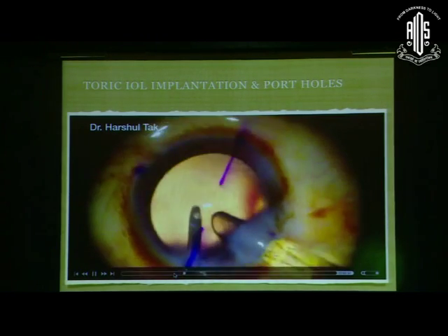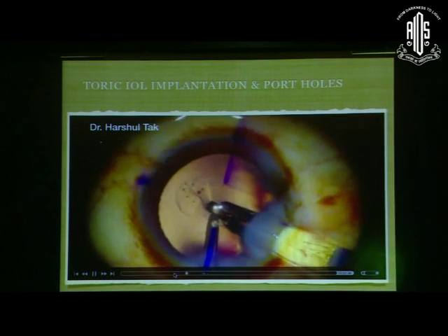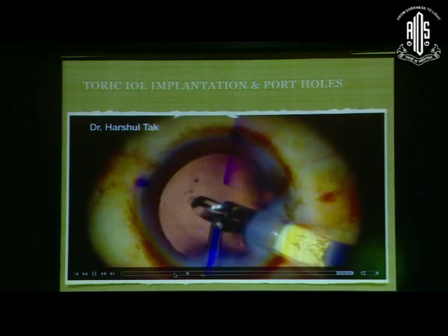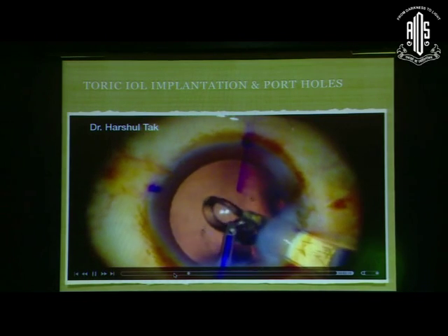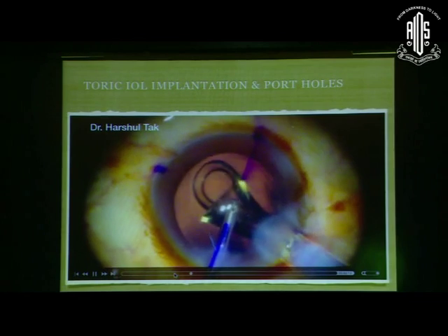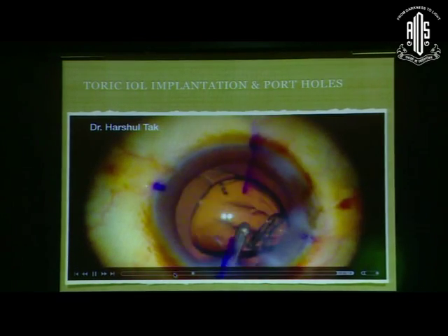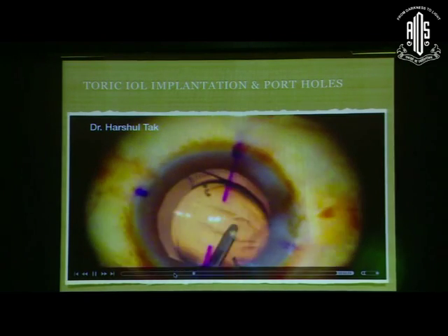So this is the hydroimplantation technique. I just put the irrigation cannula in the anterior chamber. It maintains the capsular bag very well. And the leading haptic and optic goes. If you are using OVD, remember that you have to thoroughly remove OVD as much as possible.